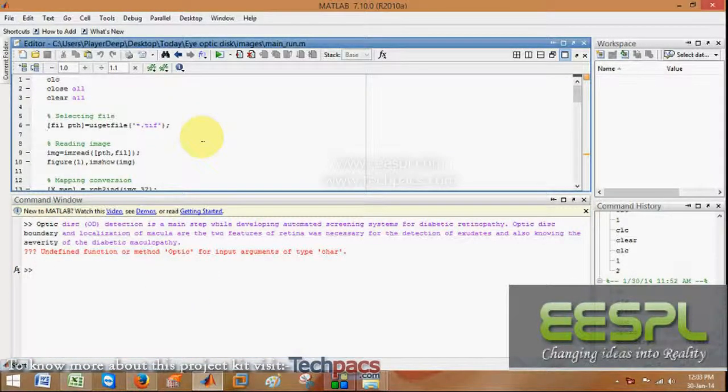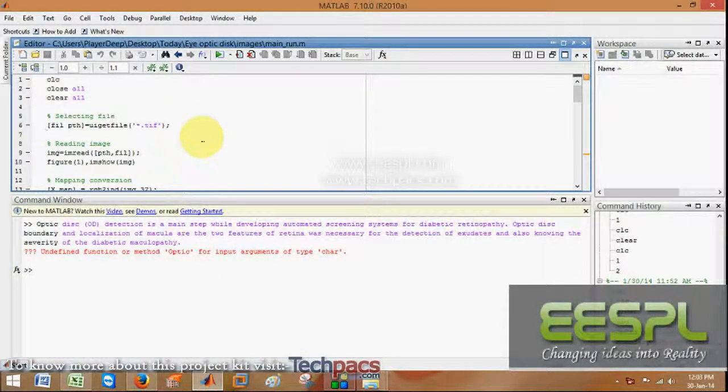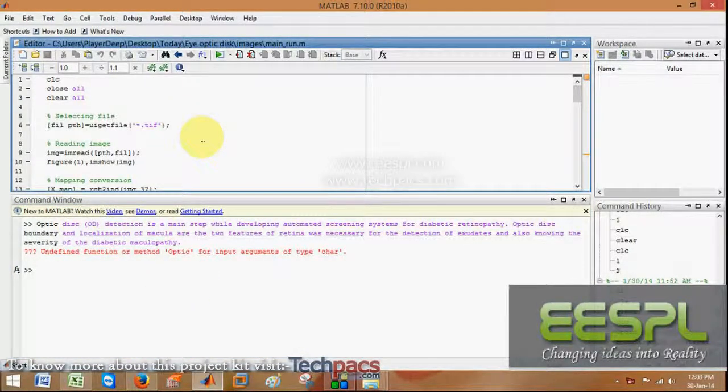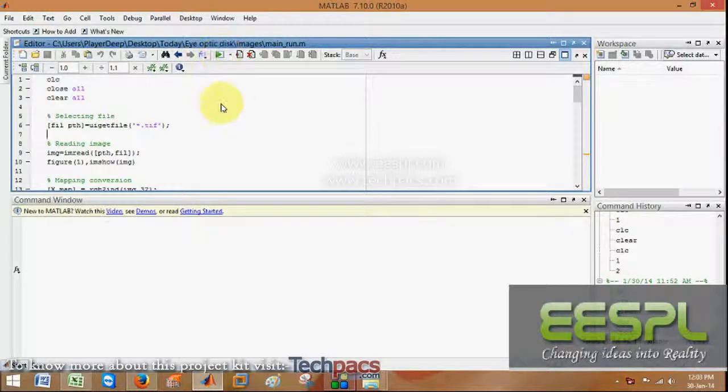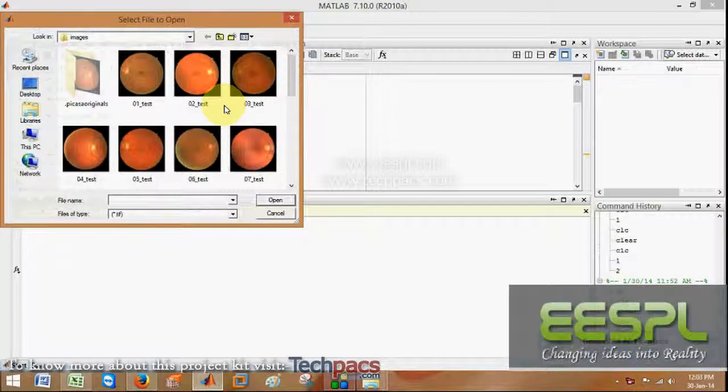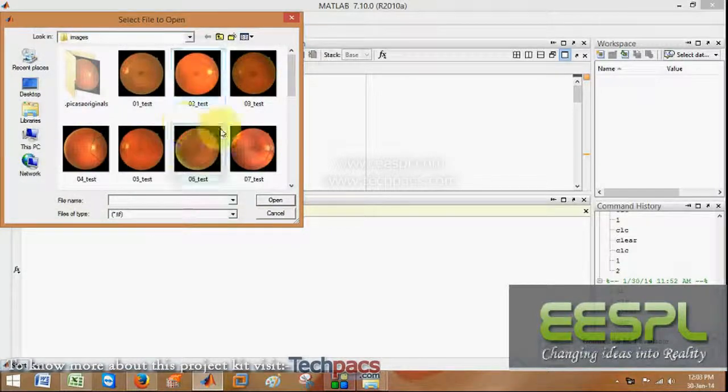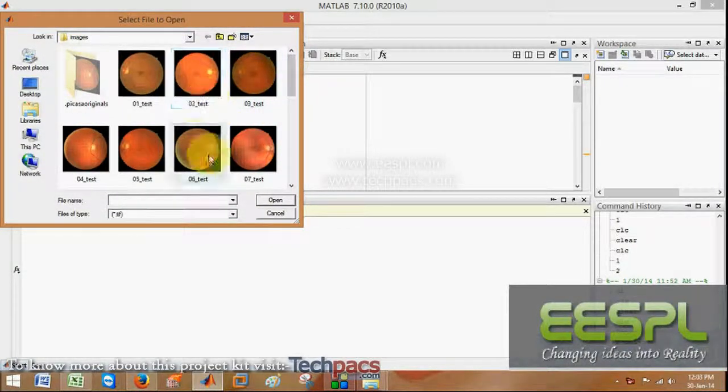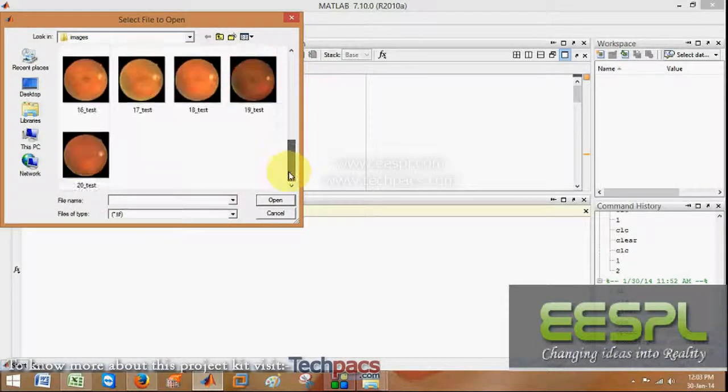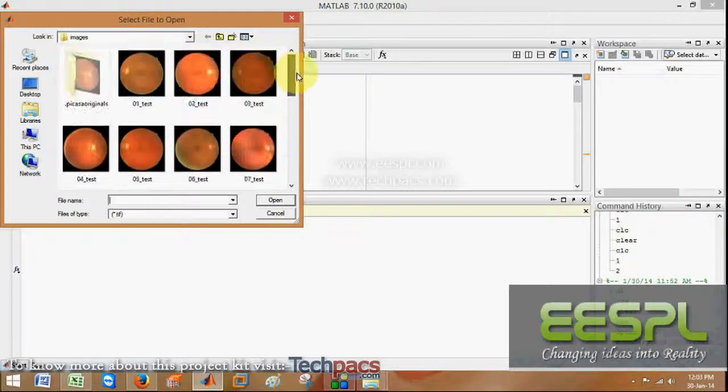In this we have used an efficient feature system which will localize the optic disc from the retina. When I run this code, firstly we have to select an image as we have many images with me.